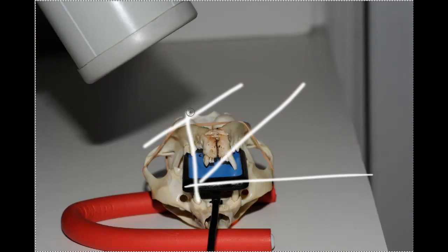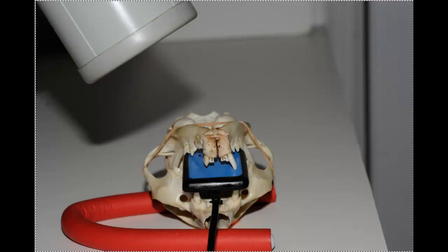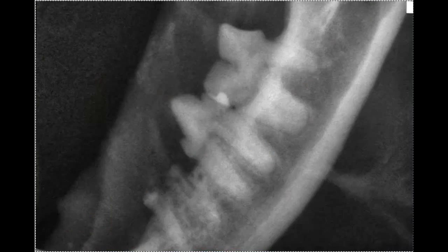And here I've just pulled the cone out a bit in order to allow me to keep my exposure at about 0.1 seconds or higher. But because I put this distance between the cone and the animal, I cut down the dose and therefore I don't overexpose. And this might be a shot that we would see as a result of that.